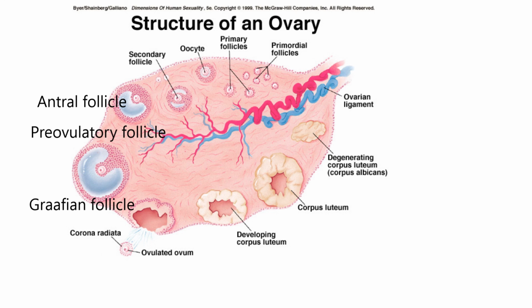So these stages here, even this one here, all occur back here. So they're not traveling along the edge. I know why they did that, because you've got to show the stages, but they never say, hey, all this happens back here. Some corpora lutea do have an open area in the middle that's fluid filled. It wouldn't have air, but it'd be a fluid-filled cavity inside. Most of the dog, cat, and so on do not.